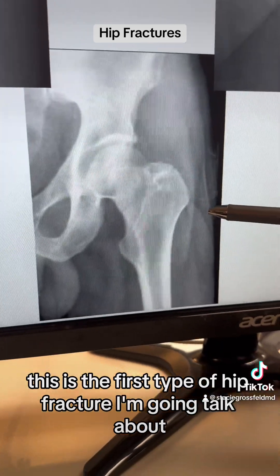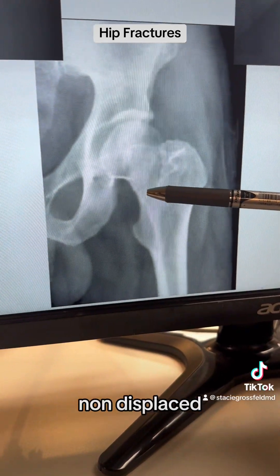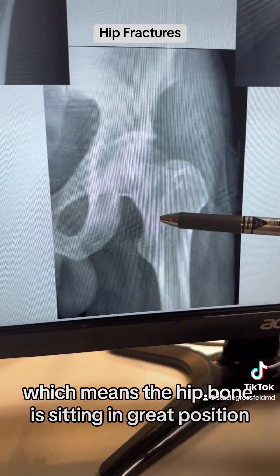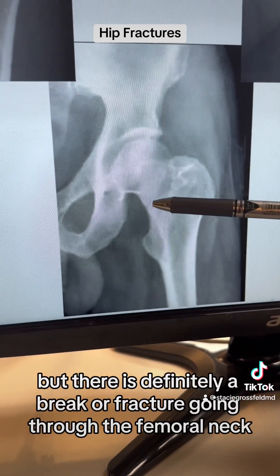This is the first type of hip fracture I'm going to talk about, which is a femoral neck fracture, non-displaced. Here is the fracture line — non-displaced means the hip bone is sitting in great position, but there is definitely a break or a fracture going through the femoral neck.